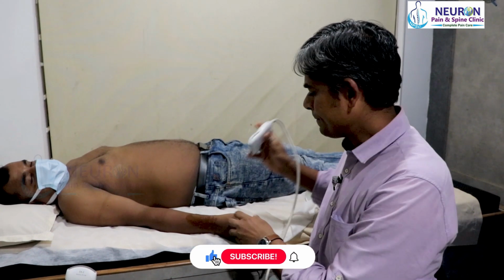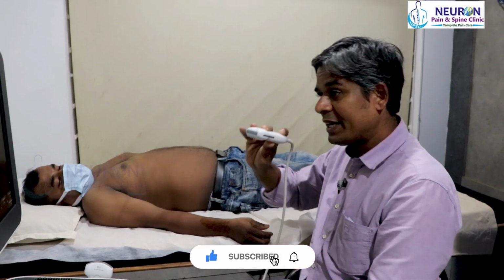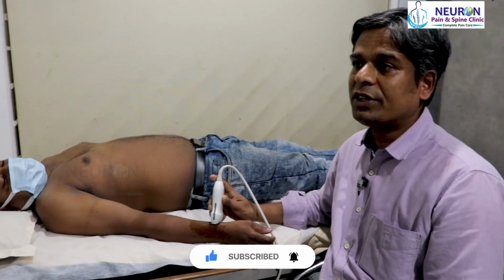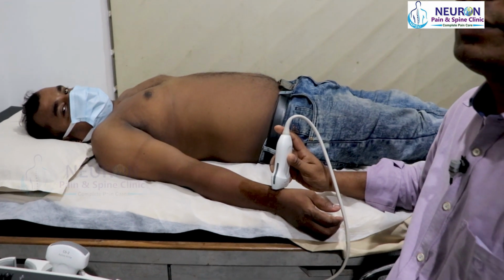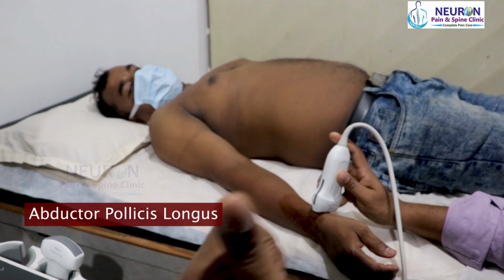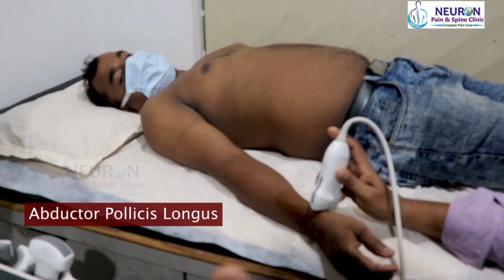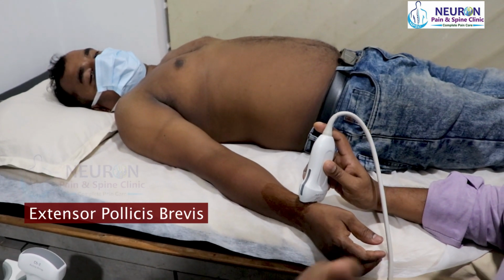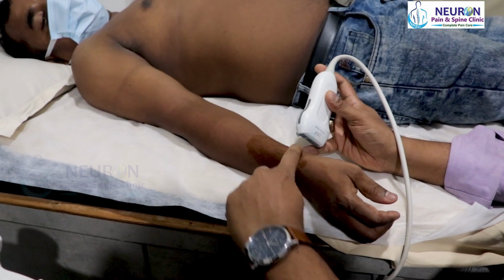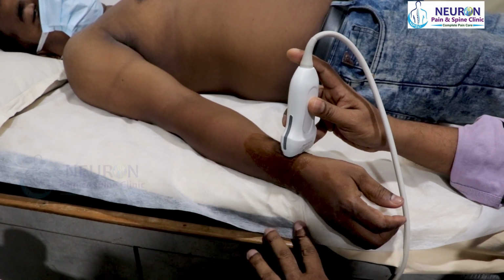So let us start. Here I am again using a high frequency linear probe. Let us start with the first compartment itself. The first compartment is abductor pollicis longus and extensor pollicis brevis. That is over the radial styloid, over this area. I'll put my probe over there.